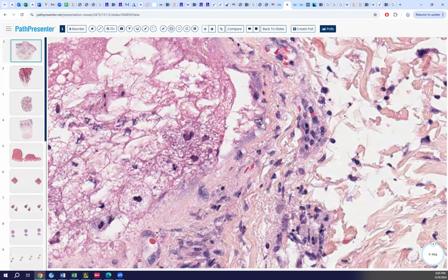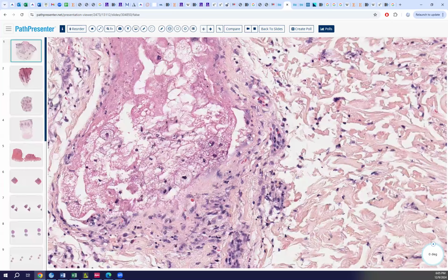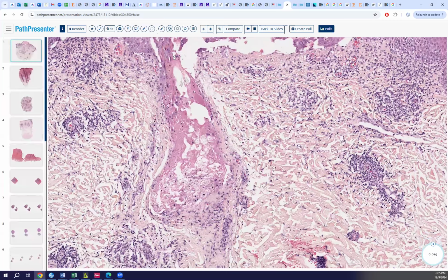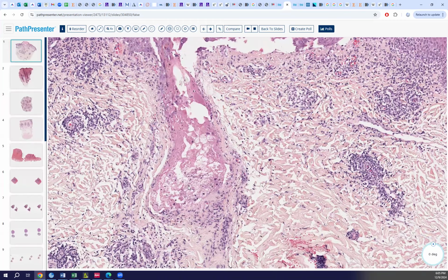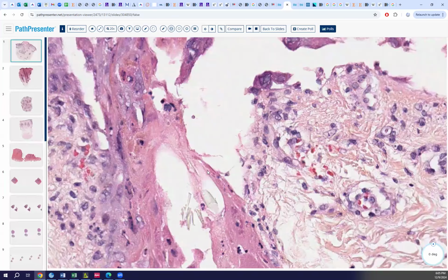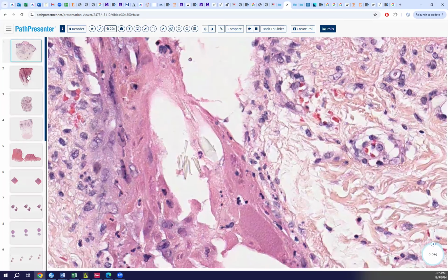He would point to this column of necrotic hair, or what looks like a column of necrotic keratinocytes, which is usually a hair. You recognize the sebaceous glands. And if you go superficially, you can see a little bit of the hair shaft. So anyway, that's usually what it is. There's the hair shaft.